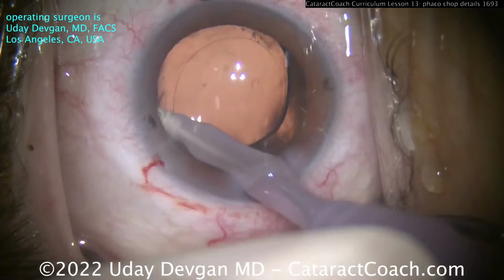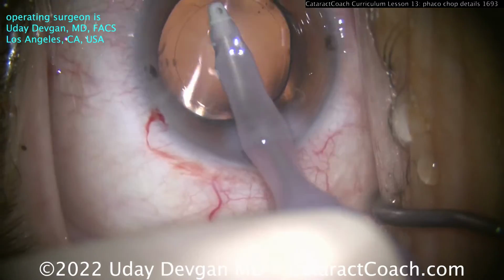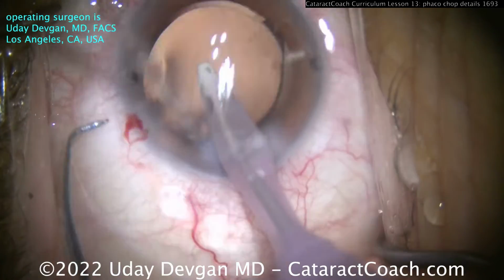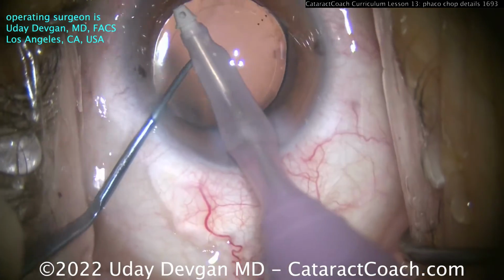And now I can clean up more of the anterior capsular rim now that I have the IOL weighing down and holding the posterior capsule away. Now it becomes a lot easier. Now you can see there are the marks on the cornea, very close to those two horizontal black marks.